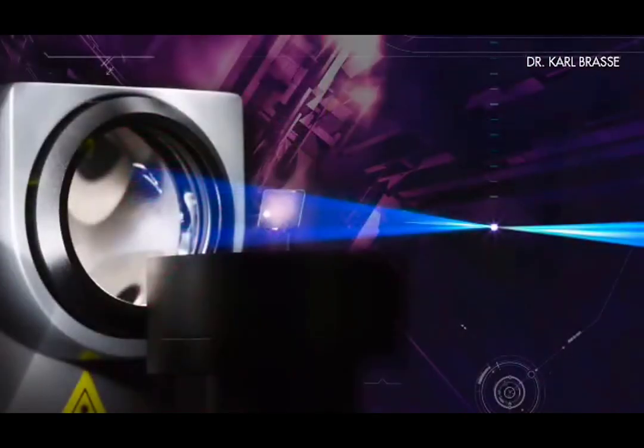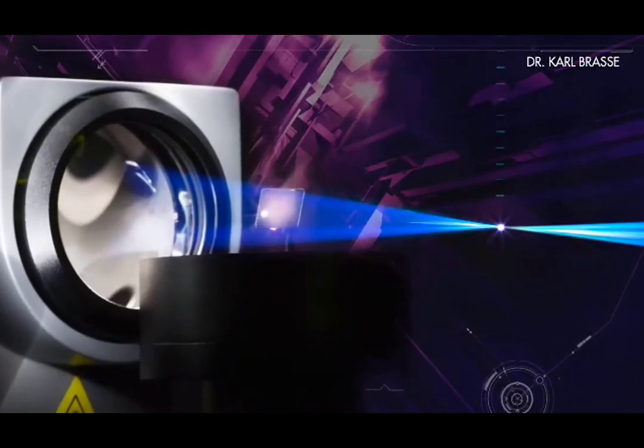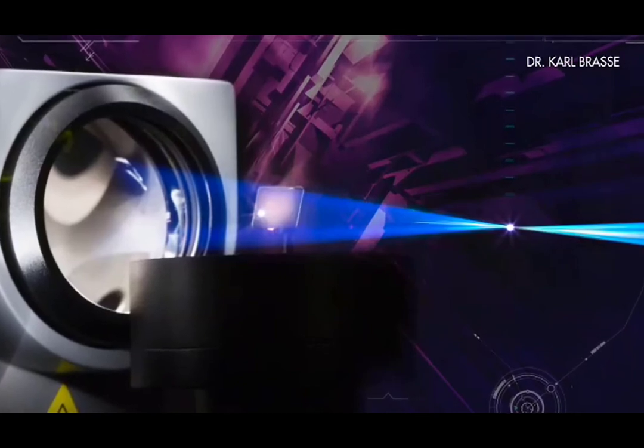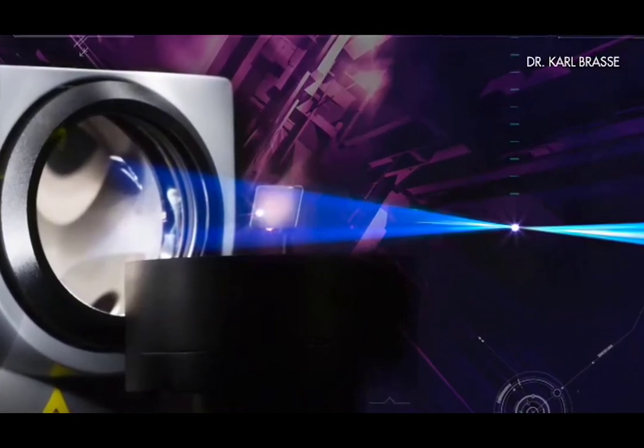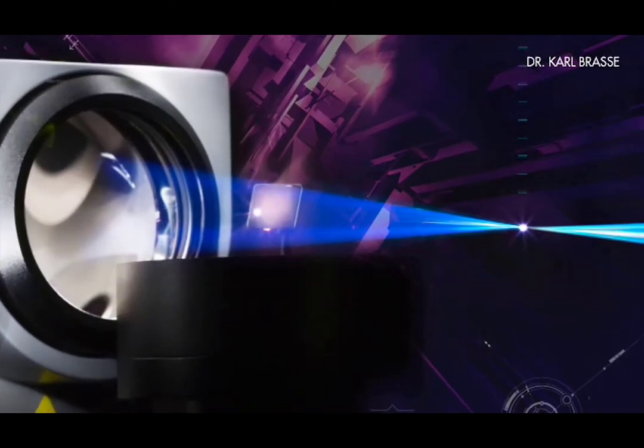Even the German Ophthalmic Society has meanwhile accepted laser vitreolysis and has adapted the official guidelines for the treatment of vitreous floaters. YAG laser vitreolysis is now accepted for certain well-defined cases. The treatment decision is based on taking a comprehensive patient history, thorough clinical examination, realistic expectations, and detailed patient information including the risks of the procedure.